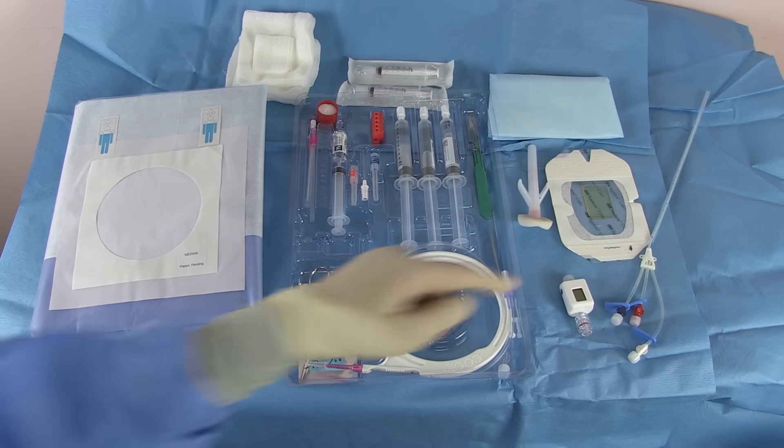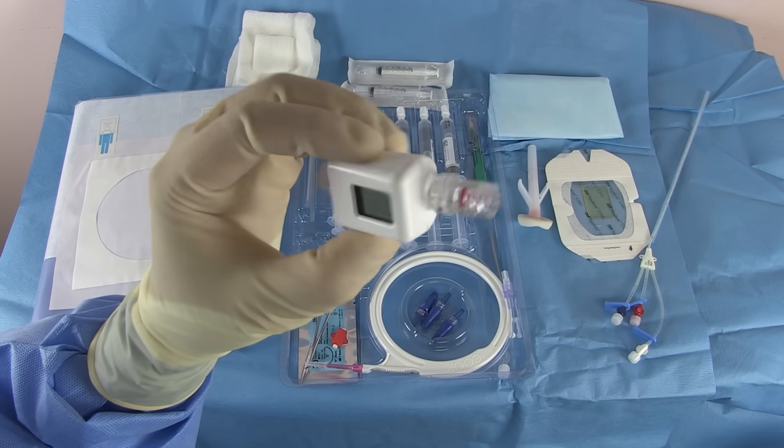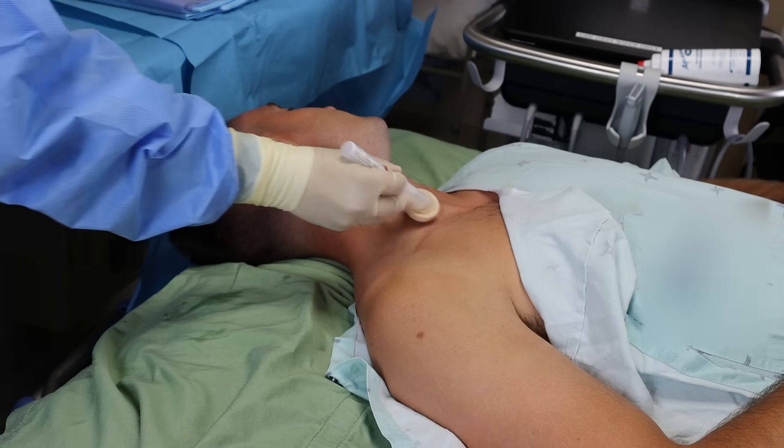I want to show you the compass pressure transducer — it measures the pressure in the vessel you cannulate. Some hospitals have them, some don't. I won't do the procedure with it, but wanted to show you in case you have them available. Let's start the procedure.